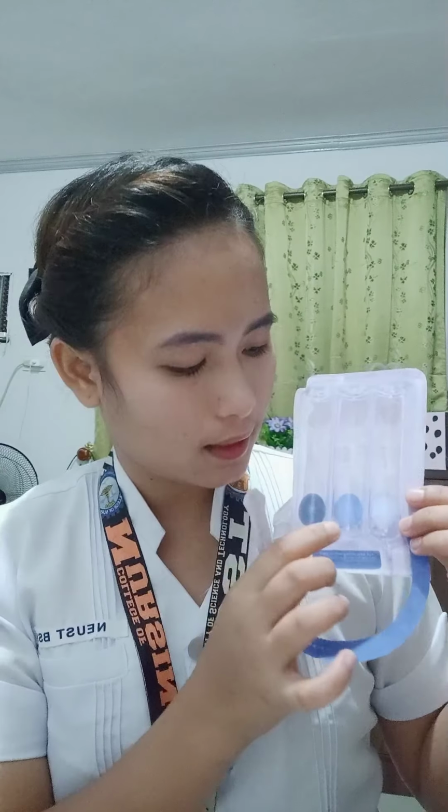Once you put the mouthpiece in your mouth, check for the first ball. This ball contains 600 cc, this is 900 cc, and 1200 cc. Then once you breathe in, the balls go up. Next is this, and then last.